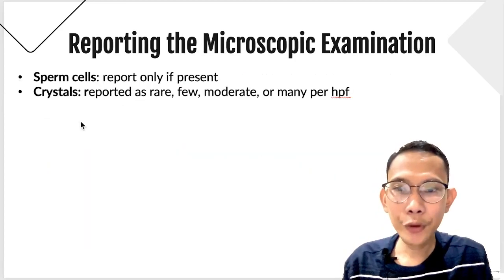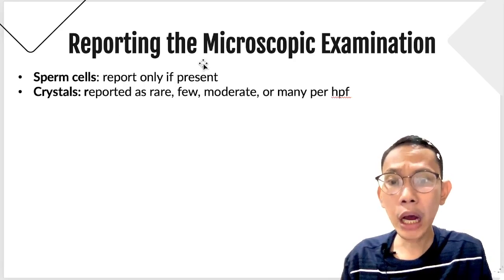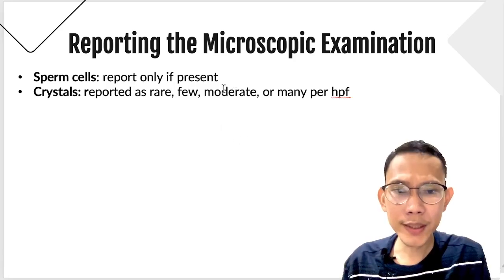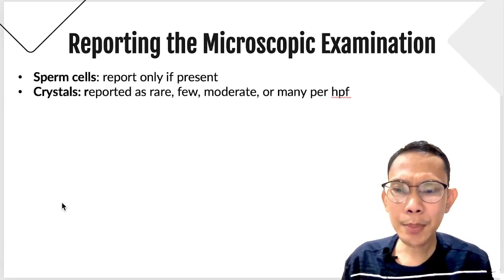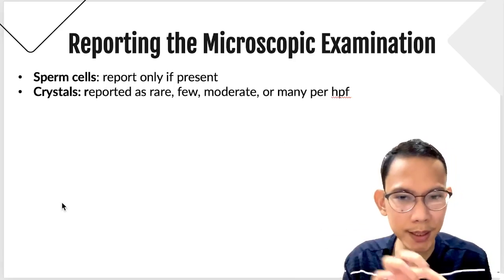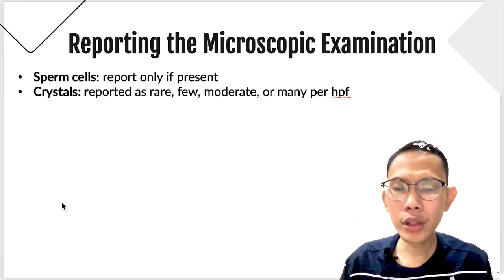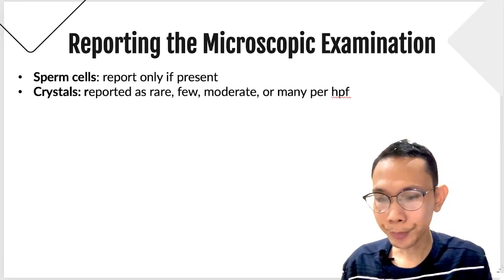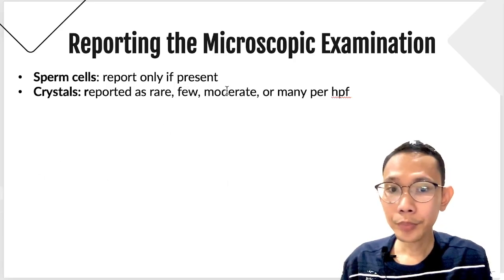And also, we have your sperm cells. Report only if present. Again, this will depend now on the hospital protocols. For crystals, can also be reported in a descriptive manner only per high power field. Your crystals may be reported as being present, positive. But they could also be reported as rare, occasional, moderate, and many. Again, this will depend on the hospital protocol. Pero sa amin, usually, ito talaga yung few, moderate, etc.